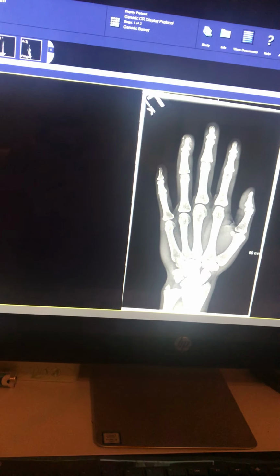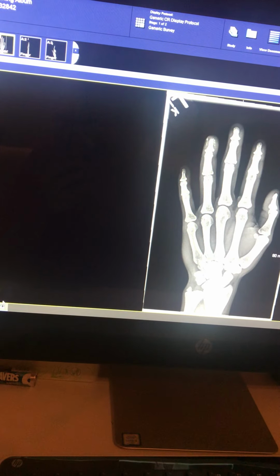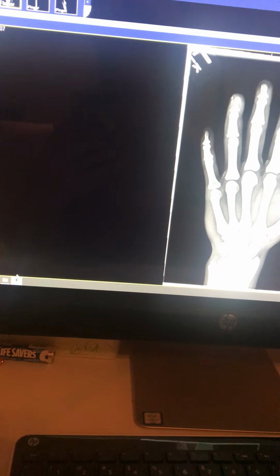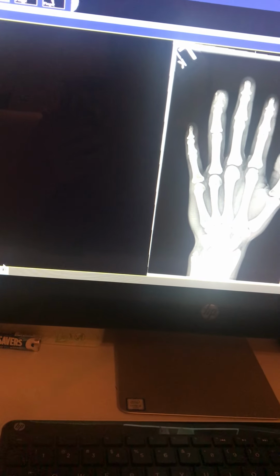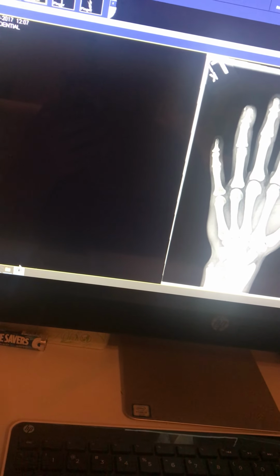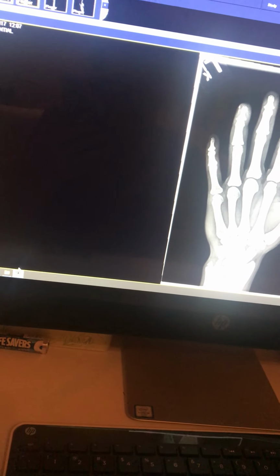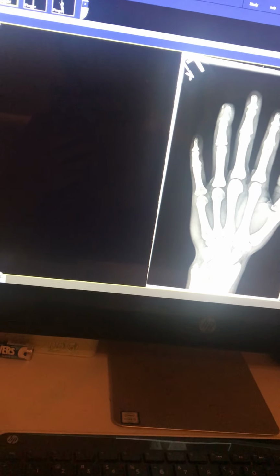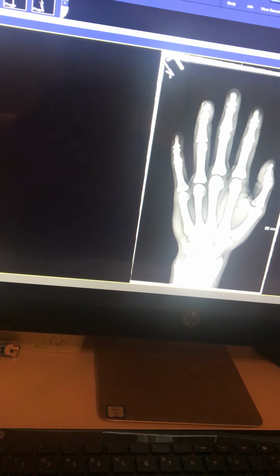The patient was a male, 20 years old. He was ambulatory. The physician's findings: all views show fracture of the terminal tuft of the 4th finger with surrounding callus formation, soft tissue swelling seen. A second fracture seen at the base of the distal phalanx of the 4th finger. Fracture extends to joint surface.